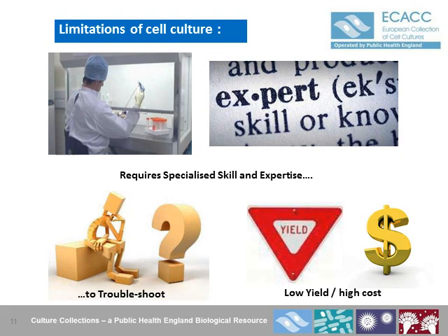Self-discipline, tight control of procedures in the facility, and an ability to identify and troubleshoot problems is critical. Scientists should be aware of the issues of cross-contamination, mycoplasma contamination, and overpassaging, and how to avoid, test, and ensure pure, authentic cultures. Finally, cell culture is inherently an inefficient process, producing very little yield of biomass for the expense and effort required, and can be quite costly.